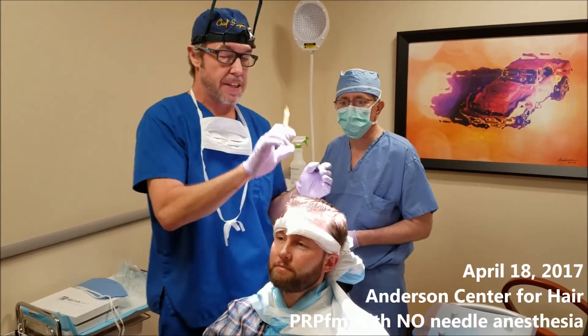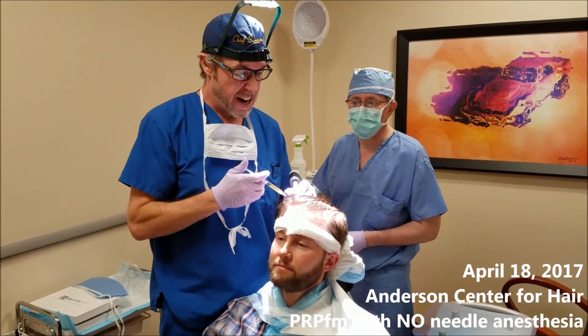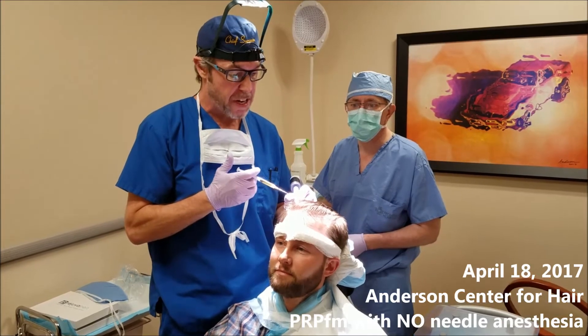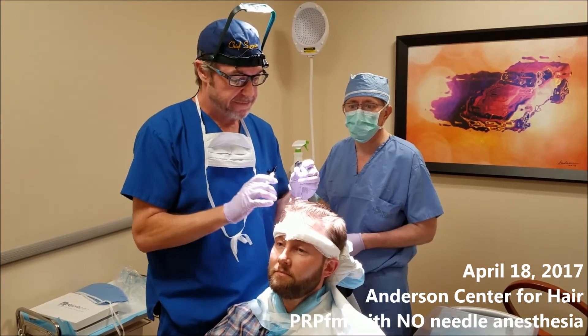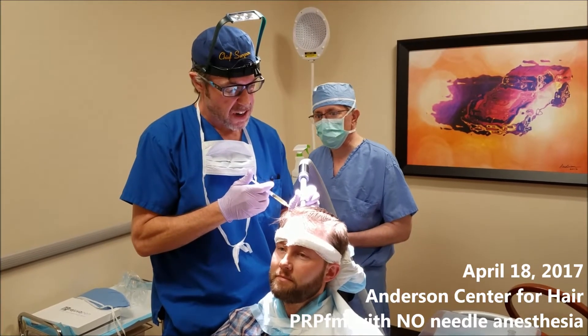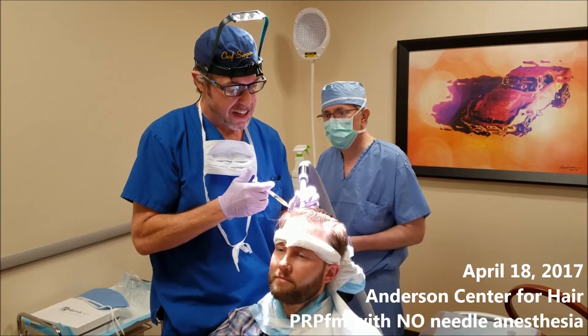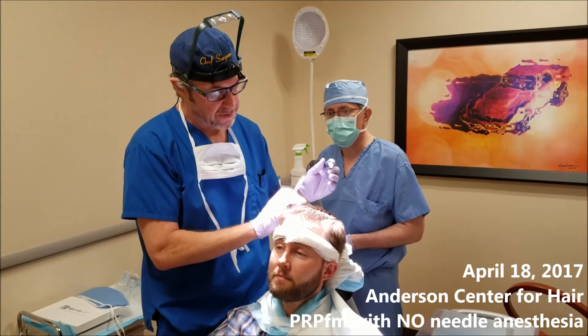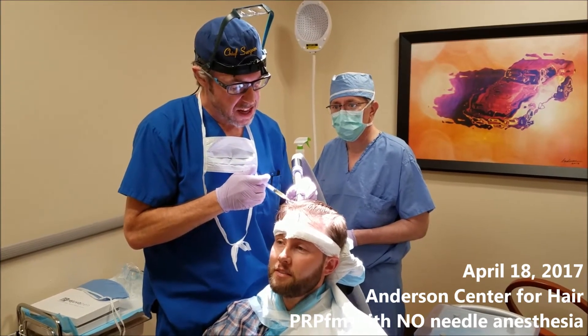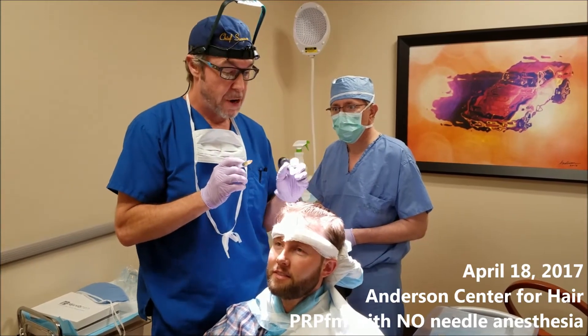This is going to change the entire scene in terms of doing these PRPs because I don't want the patient to feel a ton of pain. I can feel pressure but no pain at all.